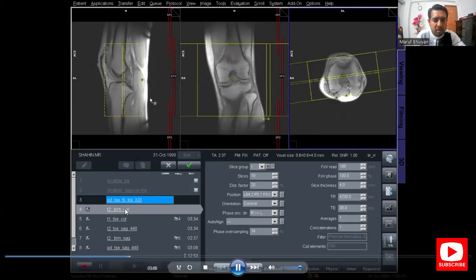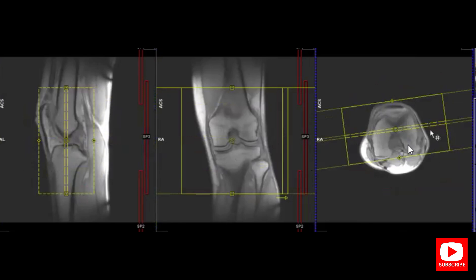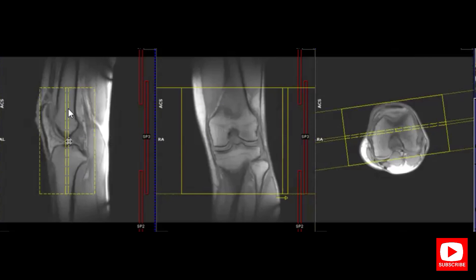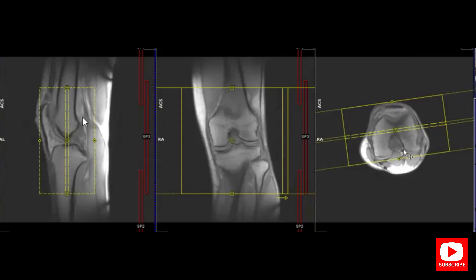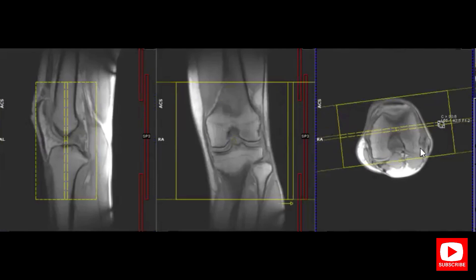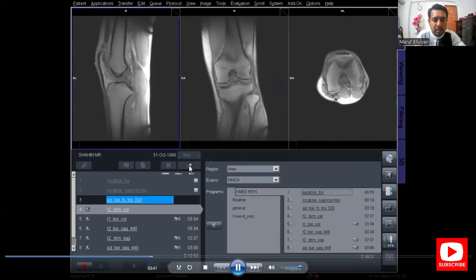Now I am planning for T2 STIR coronal. For the STIR coronal image, plan on the sagittal and axial image. On the sagittal image, angle the slices so that they are parallel to the midline of the femur and tibia. On the axial image, the slices are parallel to the medial and lateral condyle of the femur. After the proper planning, click the Apply button.